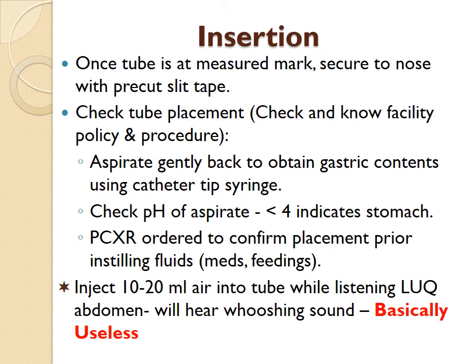And then if you put your stethoscope on the left upper quadrant, right about 2 inches below and 2 inches to the left of the xiphoid process, you can gently hear a whooshing sound when you instill that little bit of air. But it could also be in the respiratory tract and you're still going to hear the air. So it's truly a basically useless test, but some facilities still utilize it.